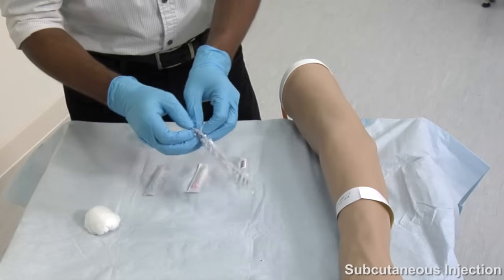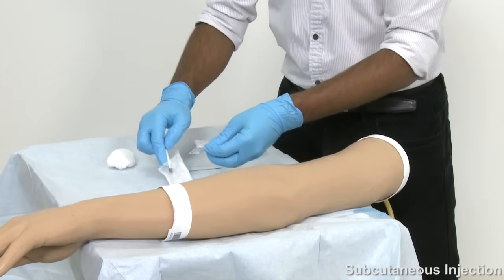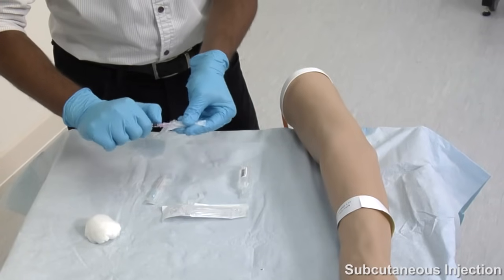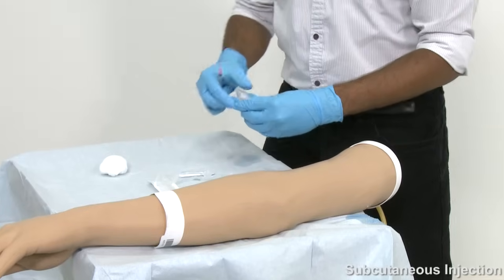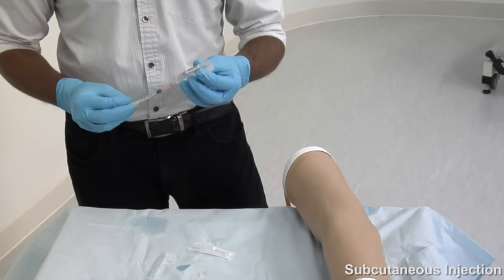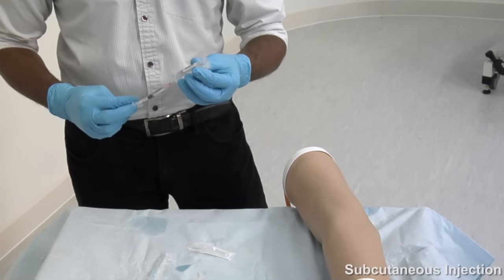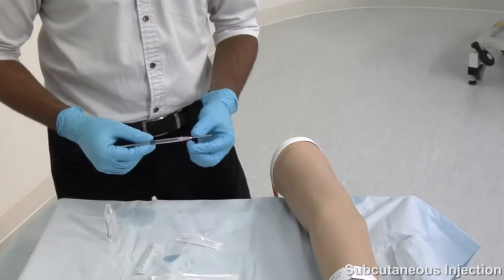After identification of a suitable site, be sure to thoroughly wash your hands. You may then begin to prepare your injection by drawing up the drug using the syringe and drawing up needle whilst wearing gloves. Once this has been done, proceed to removing the drawing up needle and attaching the injection needle.